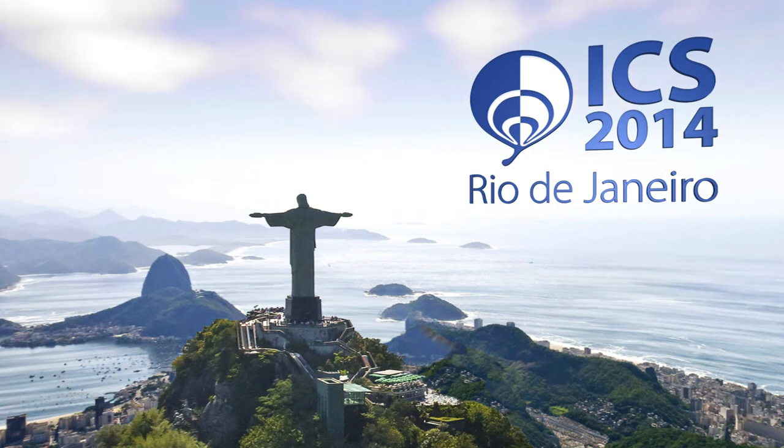Of course, there are some words about clinical prediction, and I think nobody disagrees, but you can raise your hand, that the predictive value of any leak point done by cough or Valsalva is very low at the moment. We have a treatment that seems to fit all with a certain success percentage. I think it's around two thirds of our patients who are happy with the standard treatment now. But leak point is not very important.